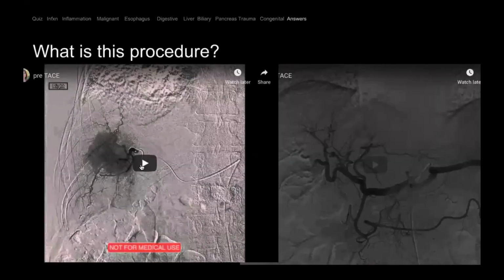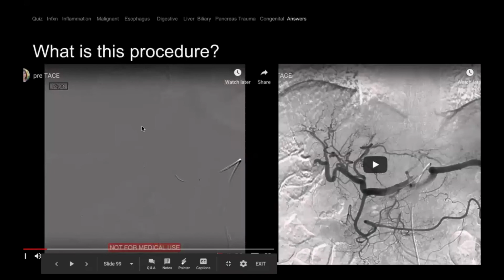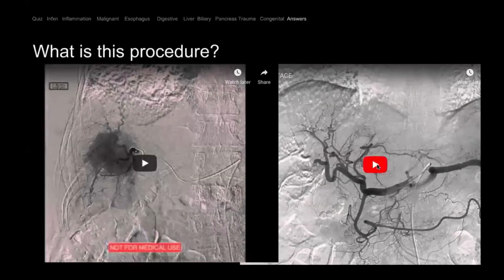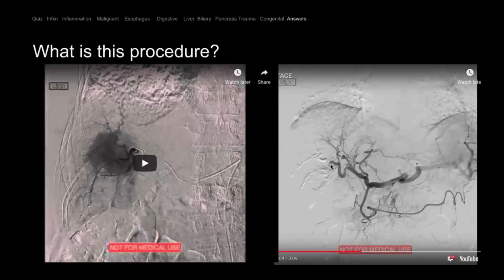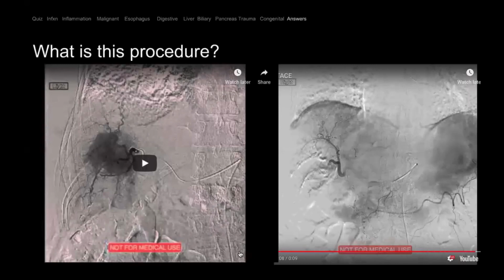This study is called transarterial chemoembolization, TACE. This is before the beads are released into the parasitic vessel feeding the liver HCC. And then this is the post-TACE ablation after the artery to the mass has been blocked off by beads. And that's the TACE run.